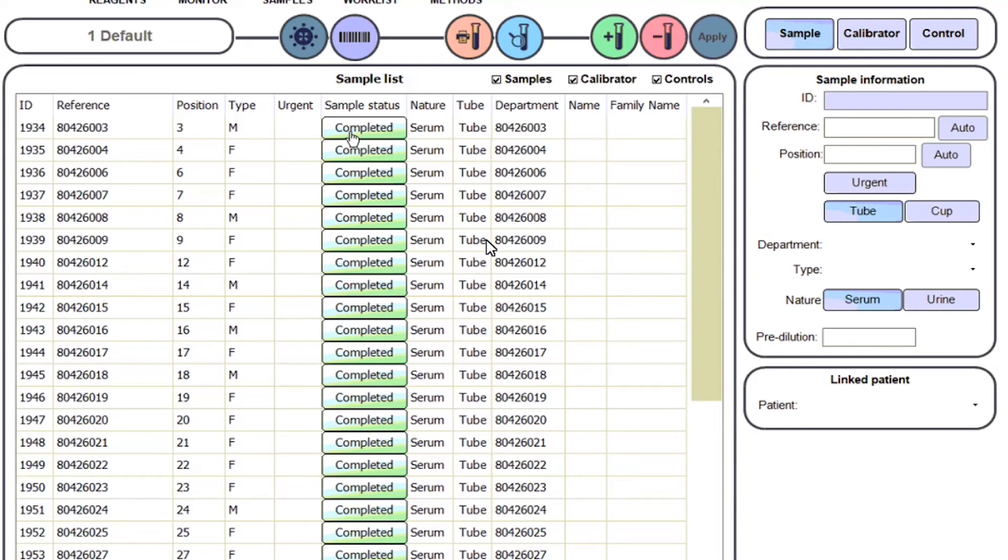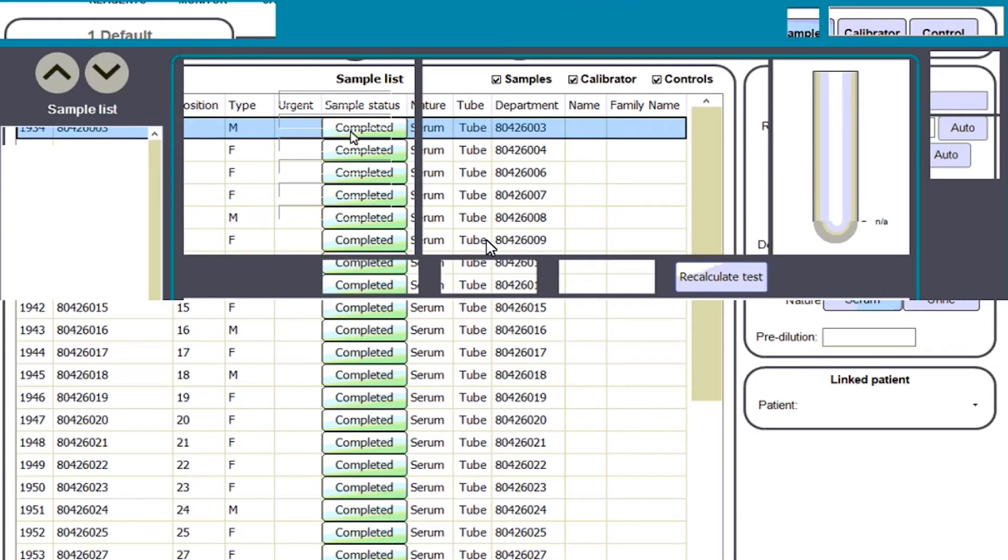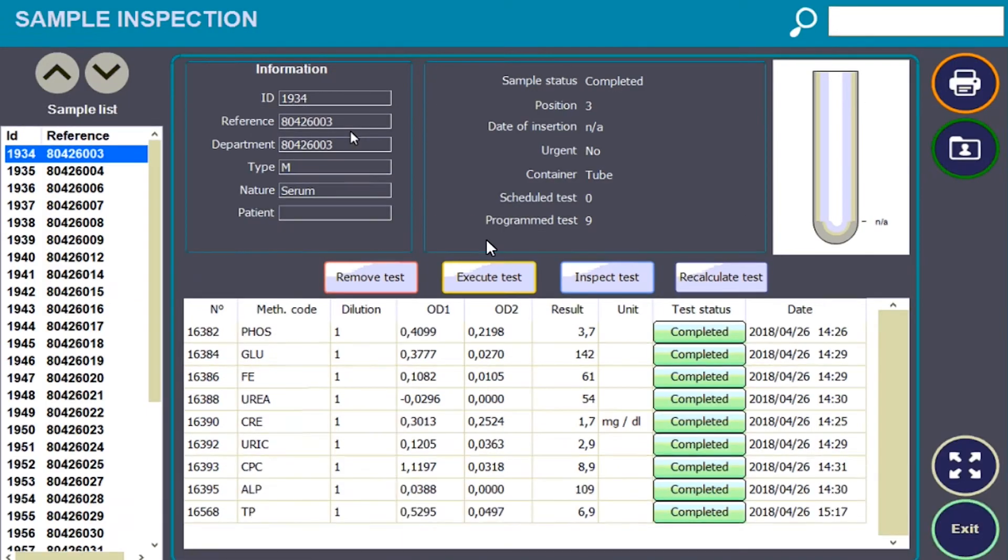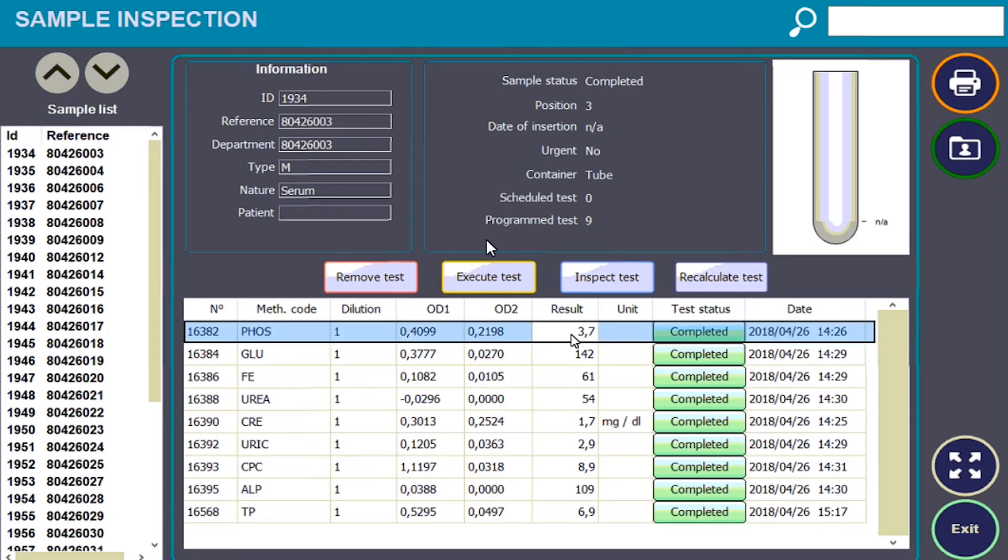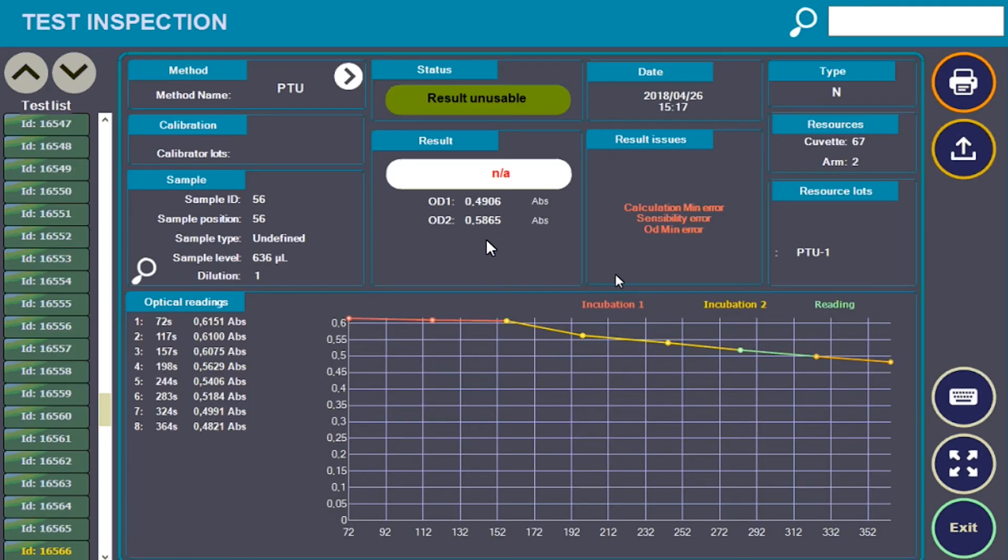In the software, there are different additional tools that allow the operator to know the details of each test performed by displaying the reaction curve and any problems related to the result.